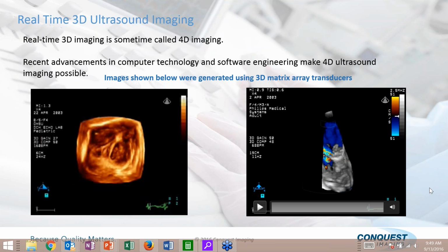And for those of you on this call, and this actually applies to the clinical applications webinar that we do, I want to take a quick tangent here and encourage you, when you get in front of an ultrasound system, please take a transducer, put some gel on it, lift up your shirt, and start probing your abdomen, moving around, pushing buttons. The best way to learn how to fix ultrasound machines is learning how to use them. You're not a complete ultrasound repair technician until you actually understand how to utilize ultrasound.